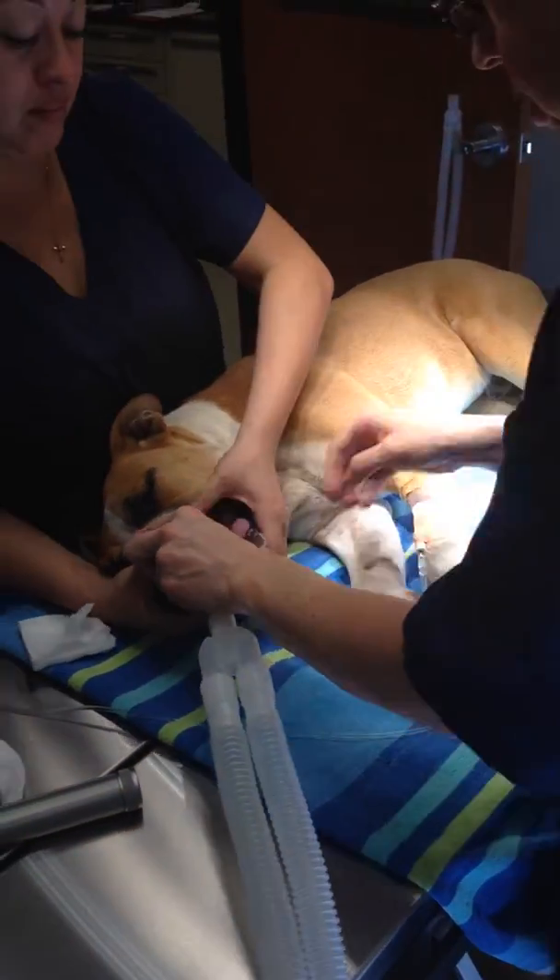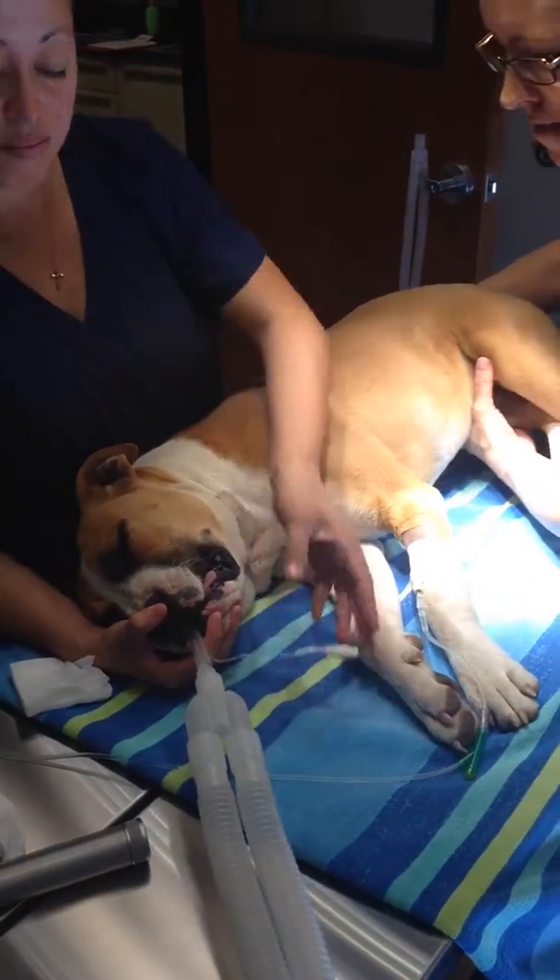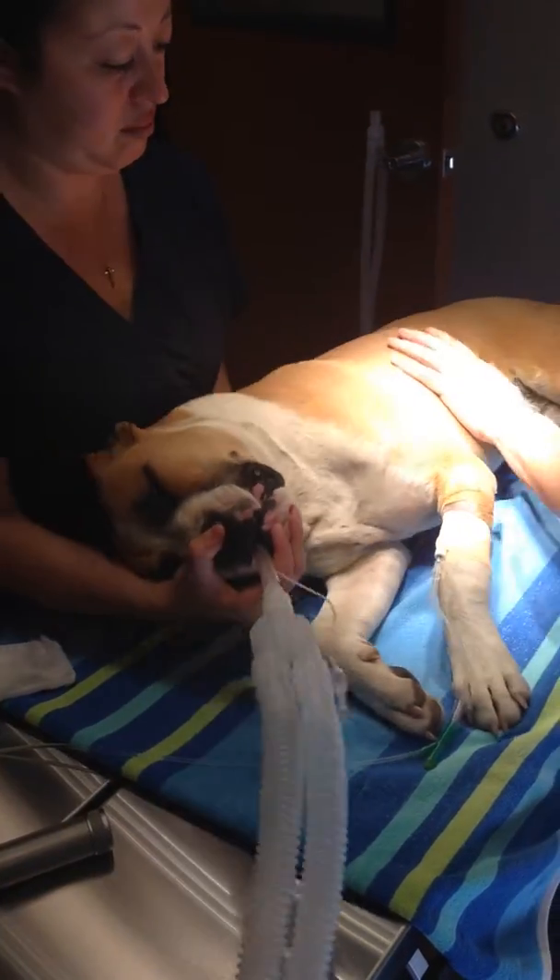We're gonna go ahead and lay him on his side. I'm gonna lube his eyes and tie in, and we're gonna inflate it.